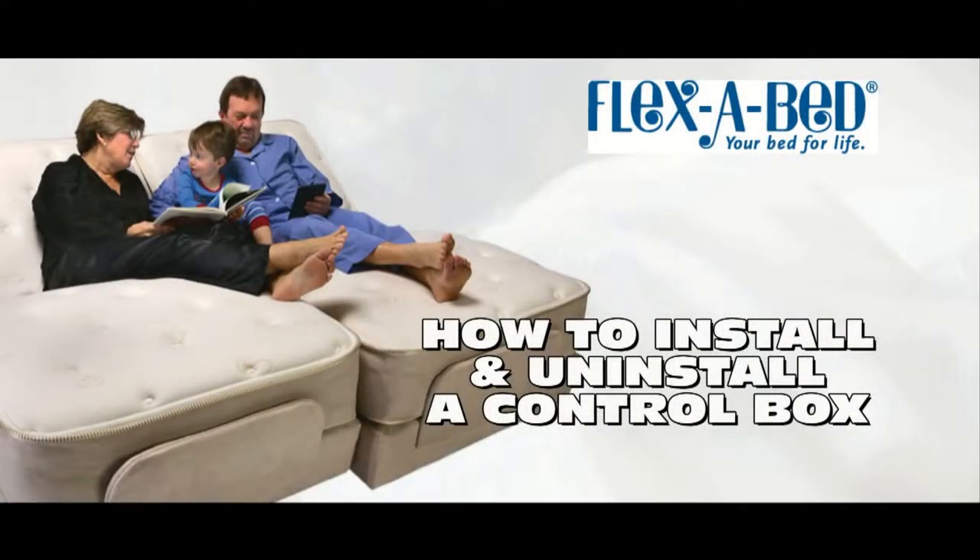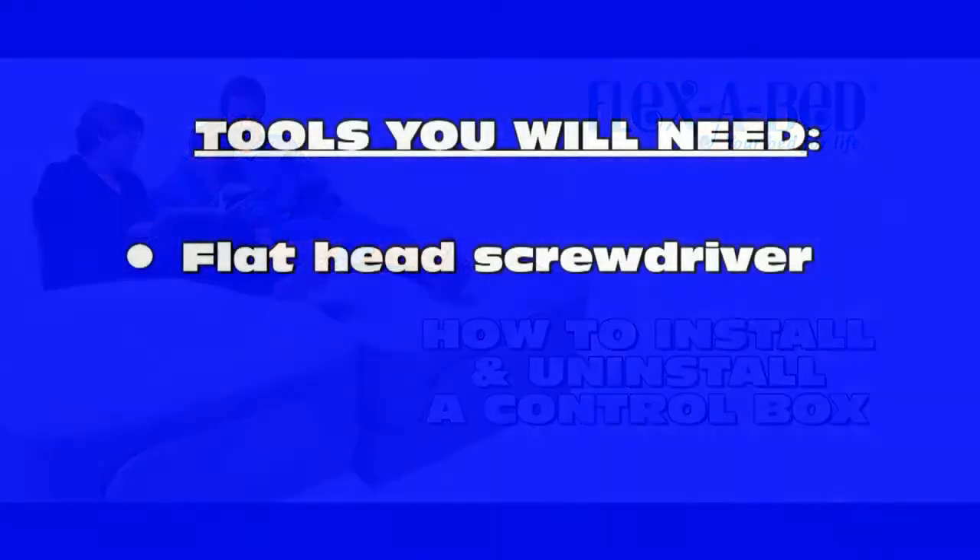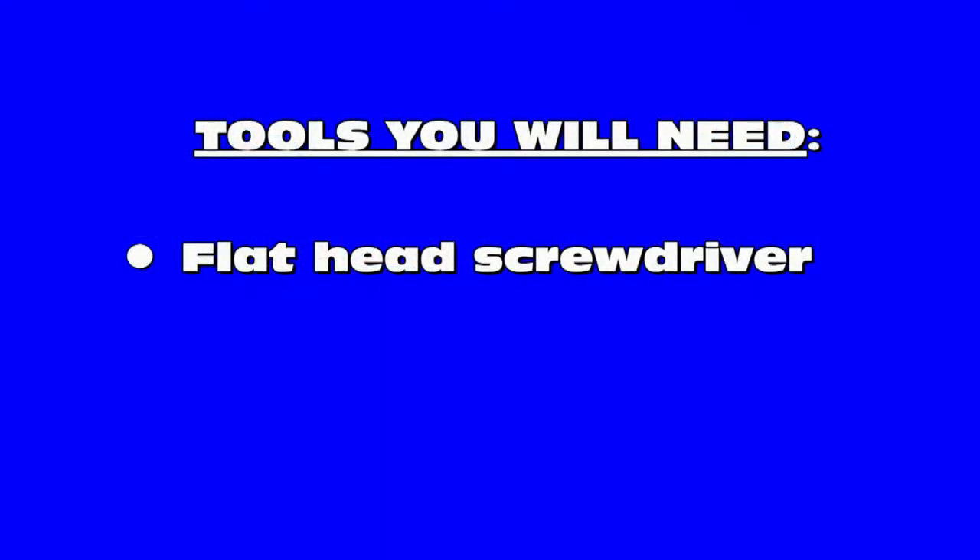Hello and welcome to this installment of the Flex-A-Bed service video series. In this video, you will learn how to both install and remove the control box for your Flex-A-Bed. The only tool you will need to remove or install your Flex-A-Bed control box is a flathead screwdriver.